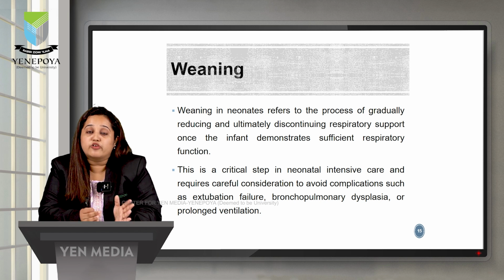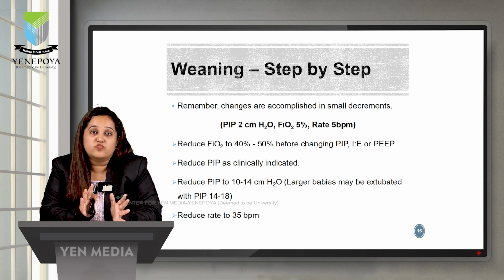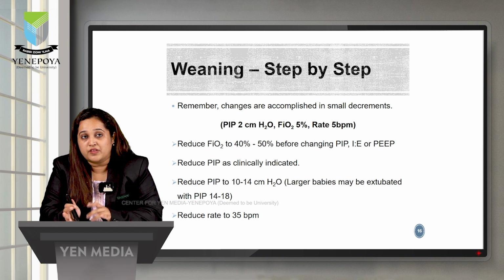So like I told you, from day one we are thinking about extubating the baby. So how do we go here? Step by step, that is the rule. You always follow the step by step rule in an ICU, and when you want to make changes, you have to remember it should be as follows.